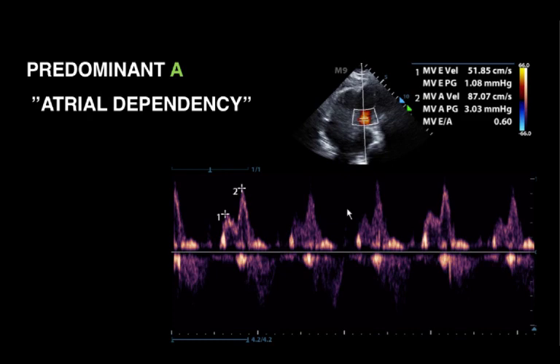We often have patients that are critically ill, that are hemodynamically unstable, that have atrial fibrillation. When you see this and you have a patient that is paroxysmally going in and out of AFib, you should consider maybe keeping that patient in sinus rhythm to optimize the stroke volume, because you know that that patient is really dependent on that atrial kick. And you can assess that easily with ultrasound. So we've done an assessment of the patient's ability to receive and take and tolerate fluids.